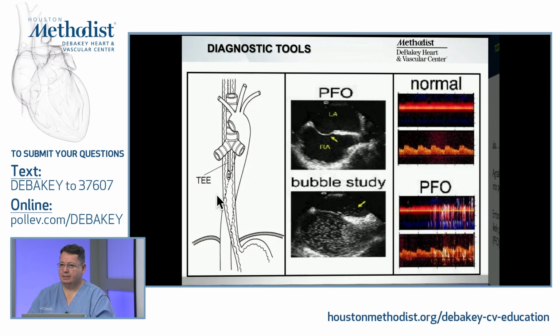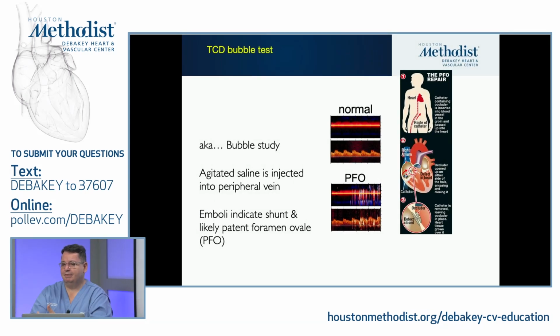You don't need to swallow anything. Just need to sit there and have an injection into your arm, and we're going to show it to you in a moment. So how we started to see, and this is actually one of those incidental findings, that a patient with a PFO, after PFO closure, reported that they have fewer headaches, and this is where the PFO and headache connection came in, but also PFO with tiny clots traveling through them, not to the lung, but to the brain, may be responsible for TIA and stroke symptoms, and we put them in a nice, beautiful cryptogenic stroke criteria.